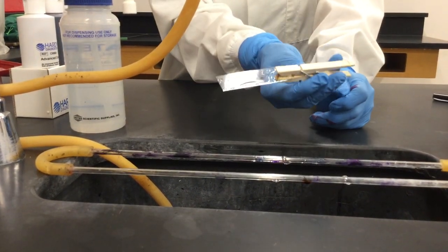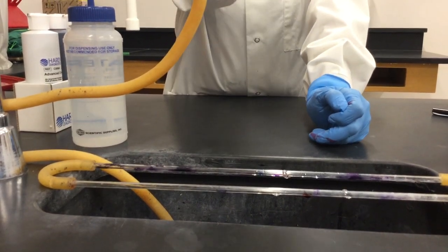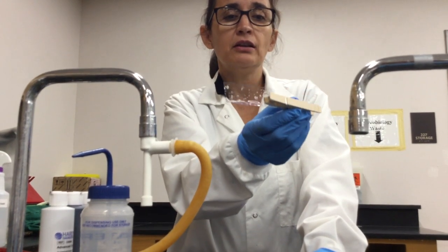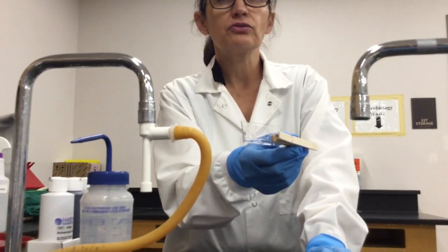Now, if you see, you don't see so much of the dye in there and so much of the bacteria, but the bacteria is there, definitely. And then once you're done, then you will look at this under the microscope.